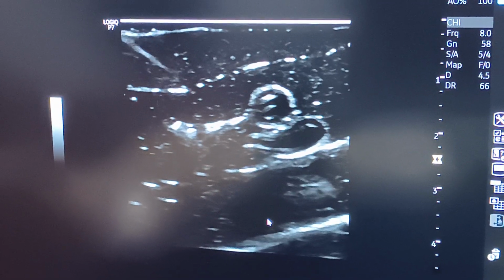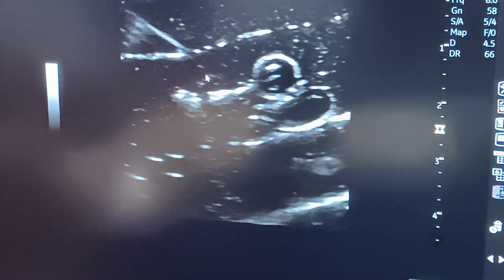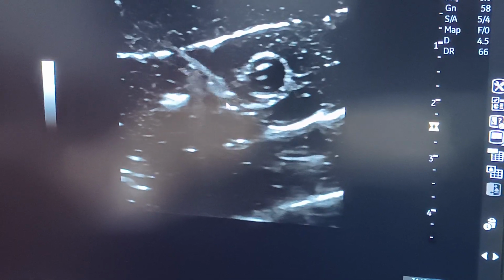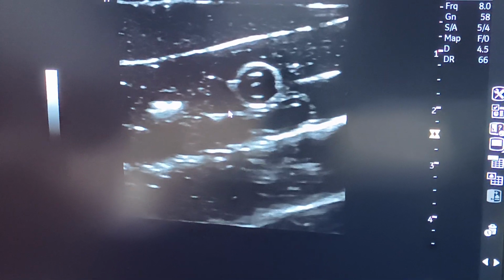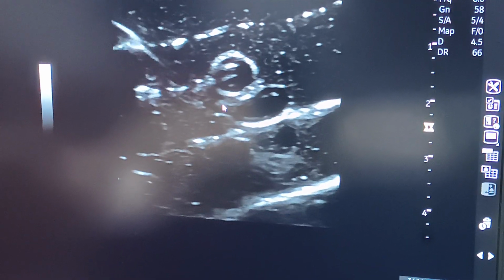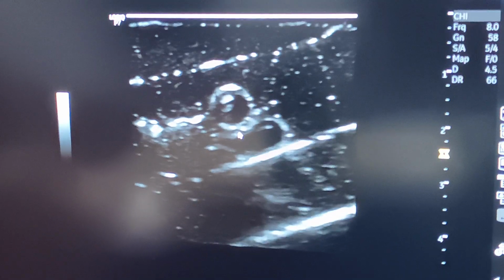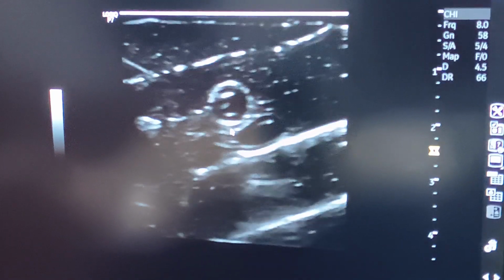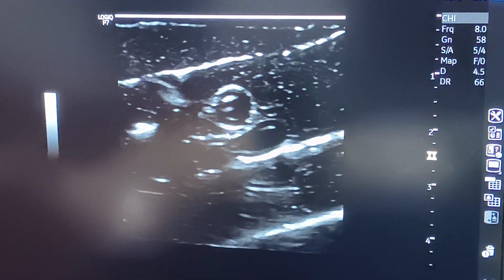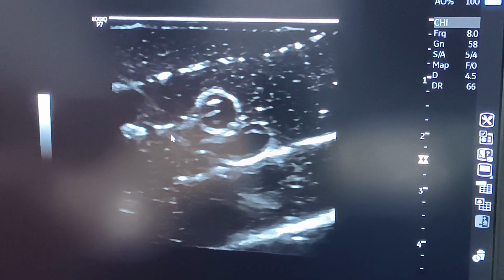That's our needle piercing the sartorius. Now, okay, here you have to deposit. So that's what you have to learn. You have to visualize both the nerve as well as the needle. So that's what you can practice here. Okay. Now the nerve is gone. You can see only the needle. Okay. Slightly lower down, it's a field block sometimes. So you can practice lower down also.